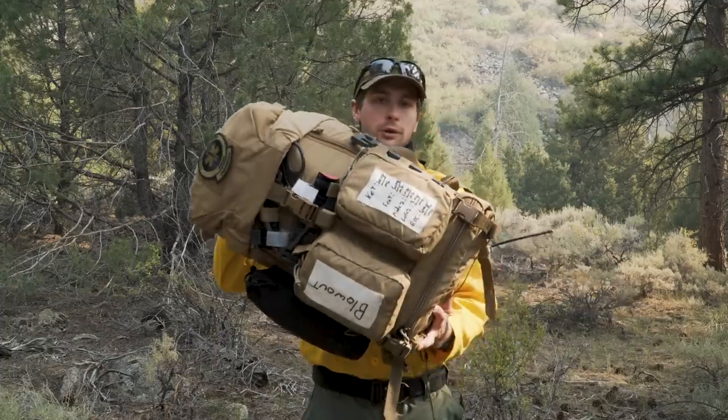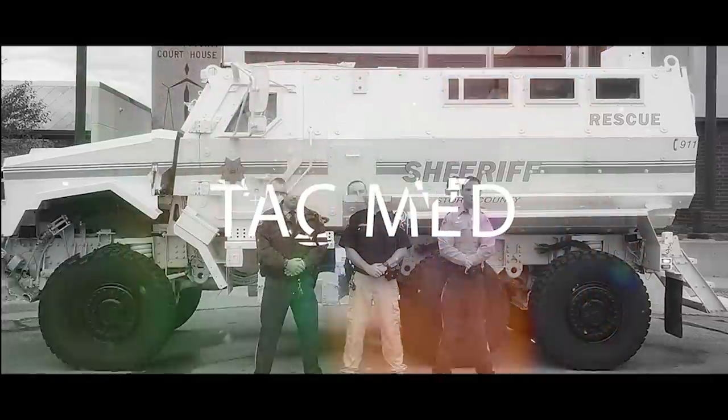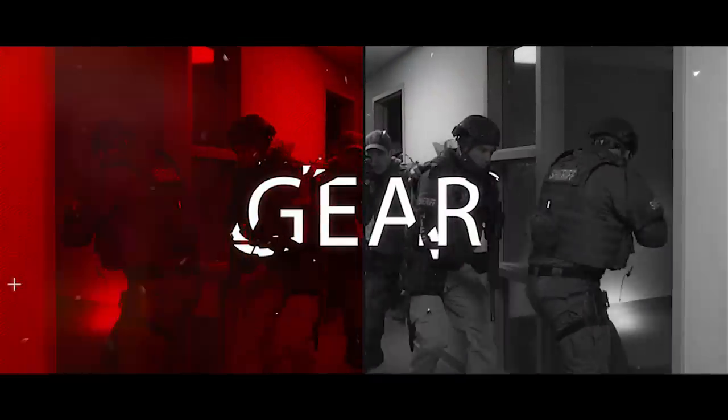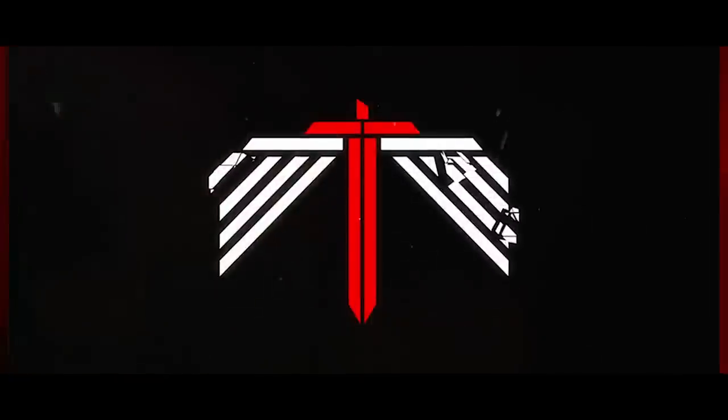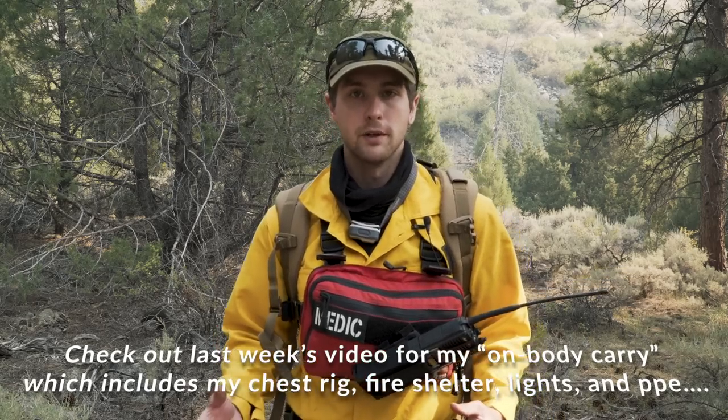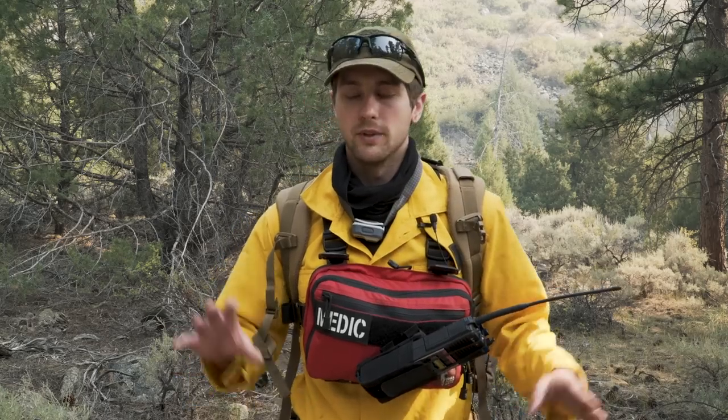Hey guys, my name is Sam and welcome to PrepMedic. In this week's video, we're going through my updated wilderness medical bag. So a little bit of context before we get started. I was deployed out as an ambulance fireline medic for a wildfire here in Colorado. This is a 14-day deployment. We camp out at one of the forward operating bases and we're basically here to support the fireline operations if somebody gets hurt — we're the medical component to that. This has given me a lot of time to think about what I want in the pack.